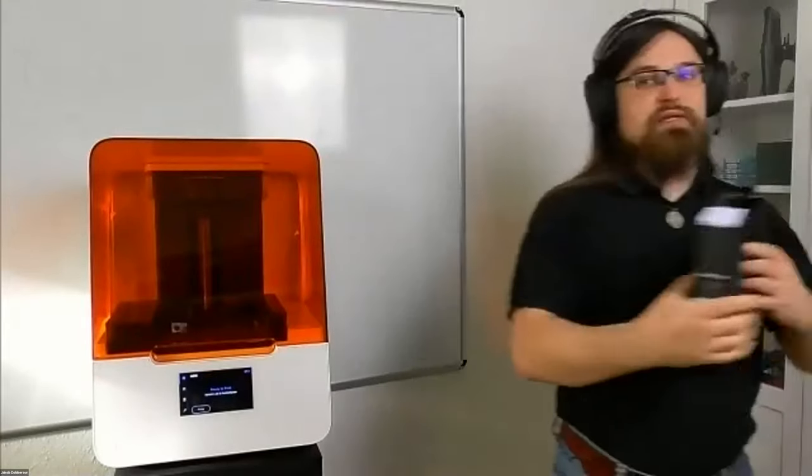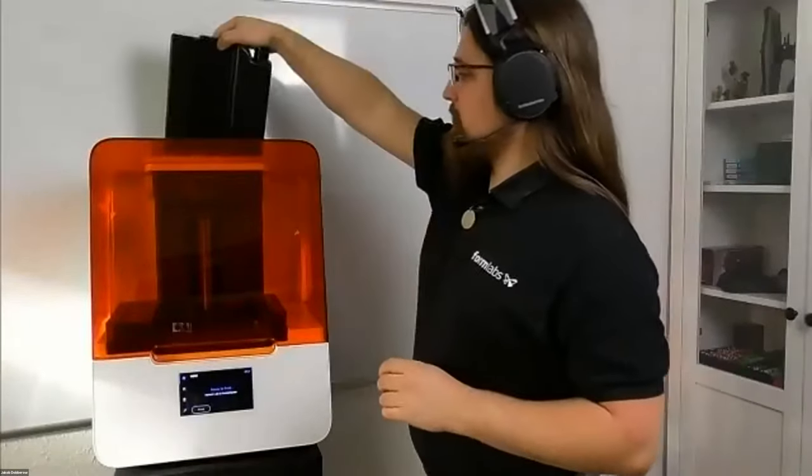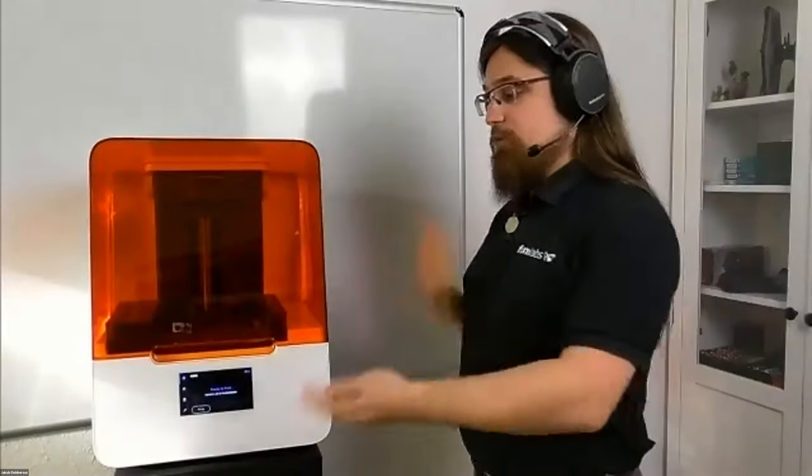And then lastly, we need the material itself, which always comes in these, we call them cartridges. There's always 1 liter of material in these cartridges right here. And you will just put that in the back and then open up the air vent that sits at the top, and that's everything you need to do in terms of preparation of the printer itself.